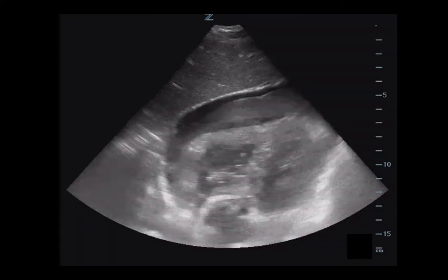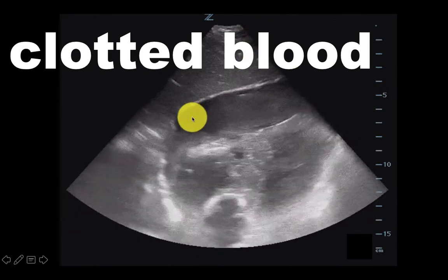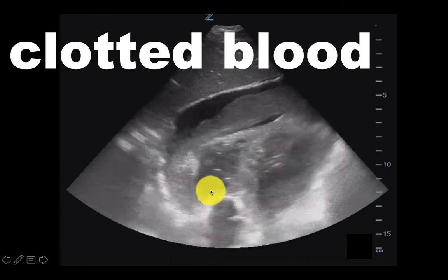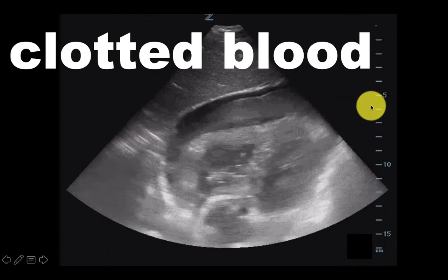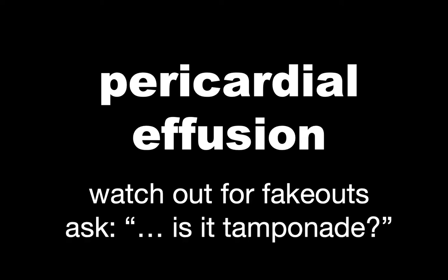Here's another example. This is actually clotted blood. This was a trauma patient, and what you're seeing is not only the presence of this effusion here, but this giant blood clot sitting right in front of the right ventricle. The other thing is that this would be concerning for tamponade. I'm seeing some collapse of the right atrium here. Again, size doesn't matter, but rather the rate of accumulation of an effusion. So again, with those pericardial effusions, watch out for those fake outs and always ask yourself, is it tamponade?